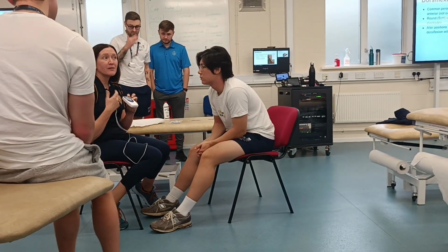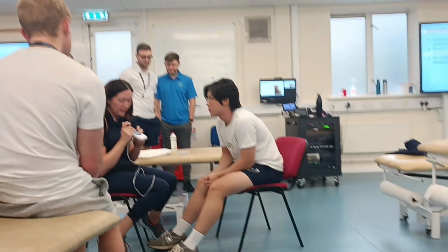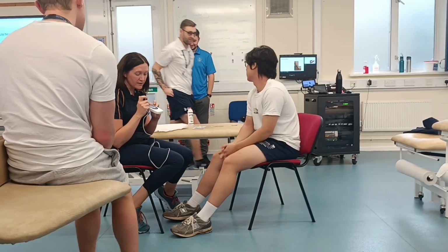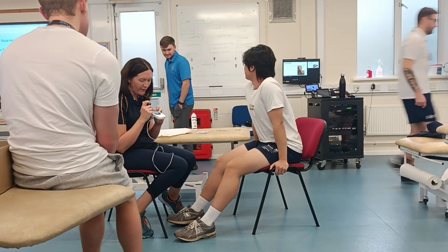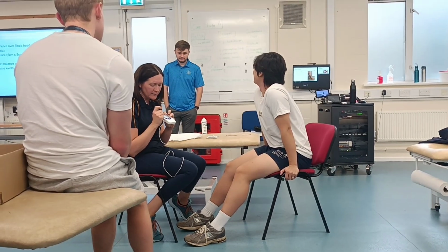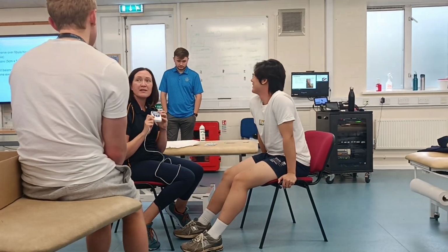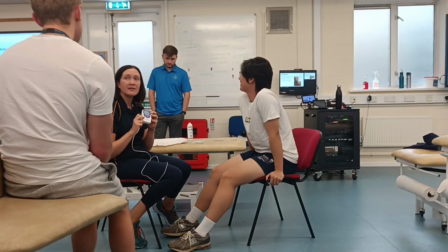Okay, so we've got that. This is the most appropriate program on this device that we would use for our patients. So 45 hertz, pulse width of 200, and it's got NMS, so neuromuscular electrical stimulation. We know it's on a neuromuscular program, not a TENS program.